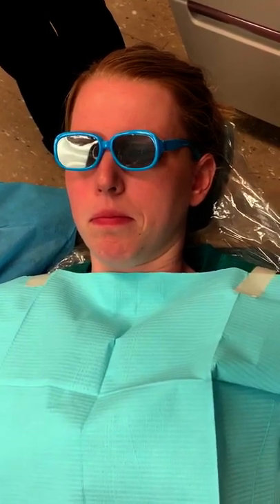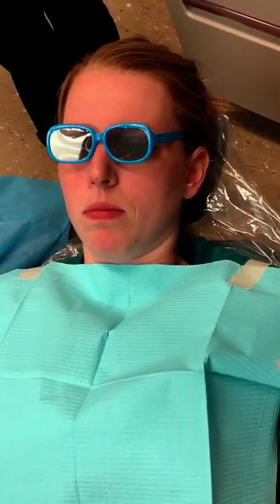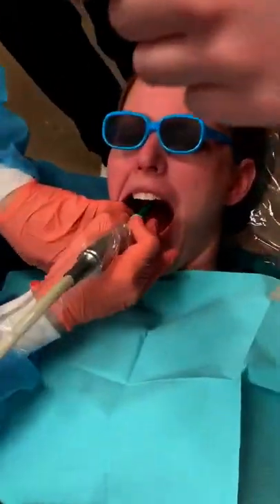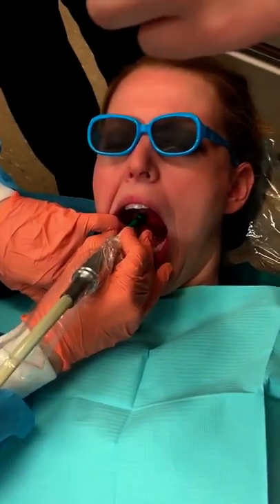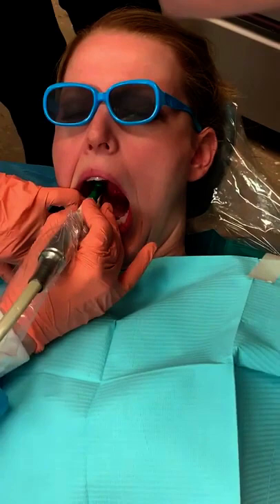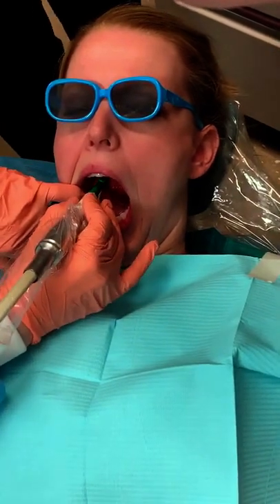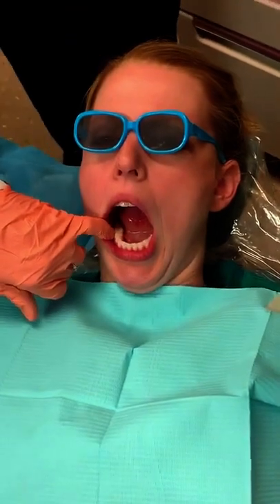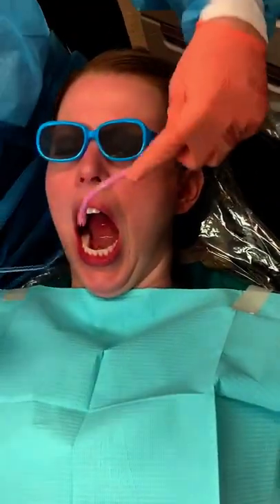First I'm going to pumice the tooth. And then if you're doing multiple sealants on a person, you can pumice all of the teeth at the same time, because they're not going to be doing anything to get anything in their teeth.